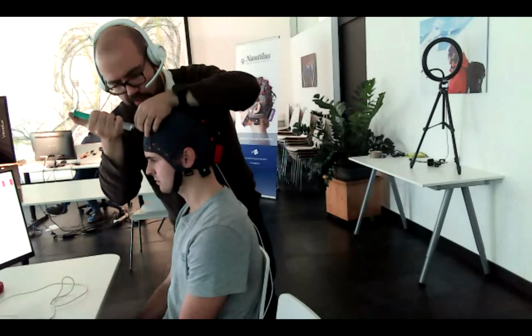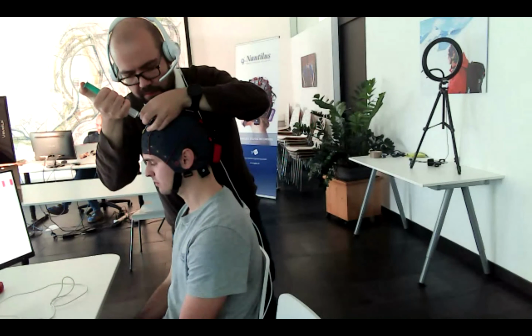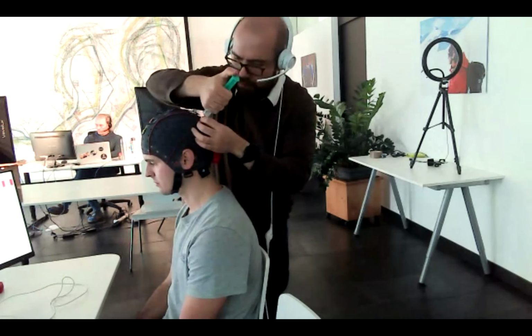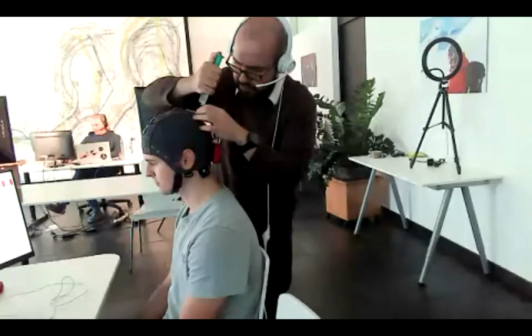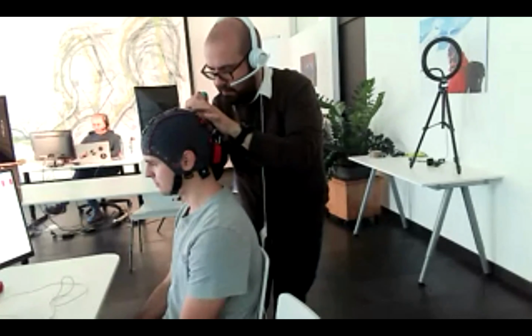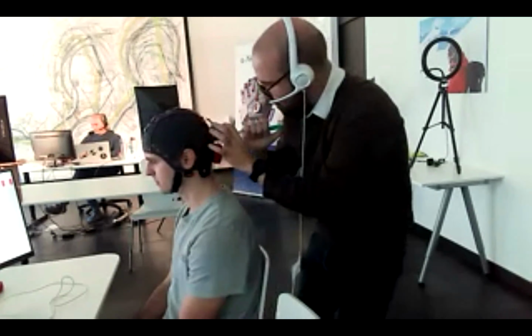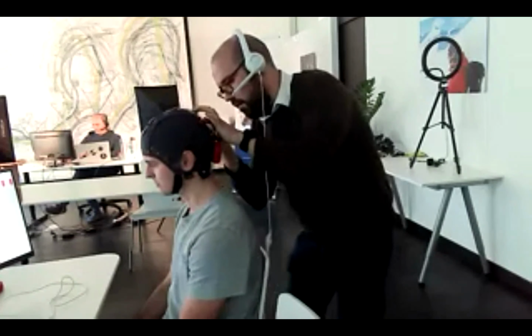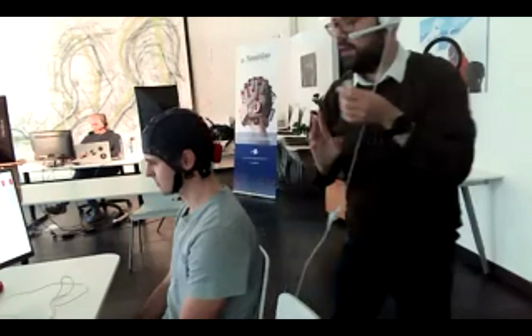And then I will just simply put on the ground, on the Fz, on the Cz, on the P3, on the Pz, and on the P4, on the PO7, on the Oz, which is channel number 8, and on the PO8. We will then be able to go to Simulink afterwards and check if the data is fine.